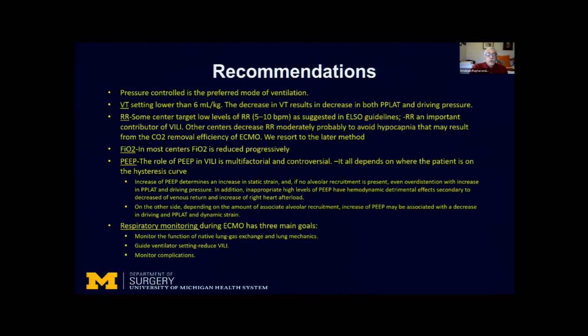In addition to suggesting a few recommendations here, it is extremely important to talk a little bit about respiratory monitoring and what the goals of respiratory monitoring are. We monitor the function of the native lung, and typically we will do that with gas exchange and lung mechanics. We do the sweep test, where we will increase the FiO2 from 50 to 100% and look for gains in oxygenation. And if we find that appropriate, then we will start trialing people off ECMO cannulation.